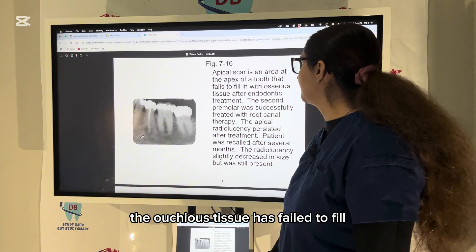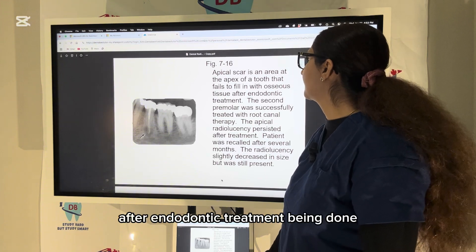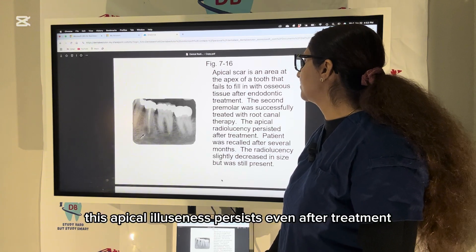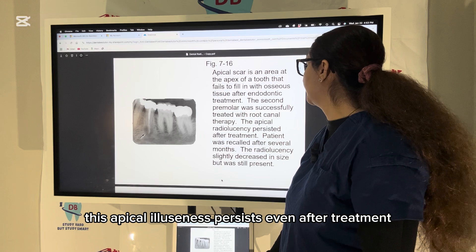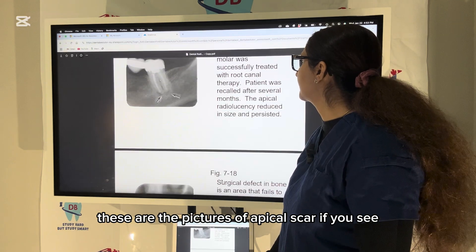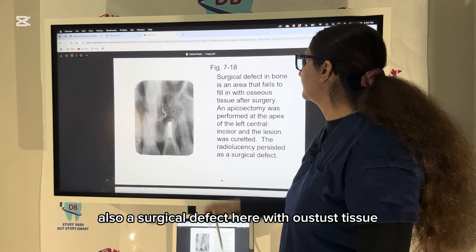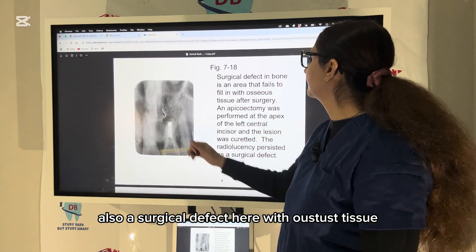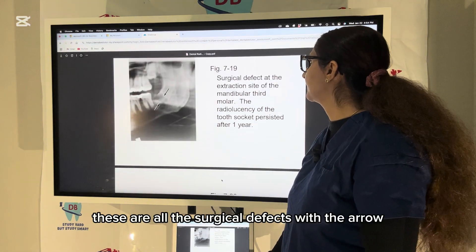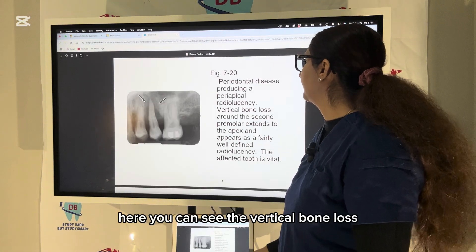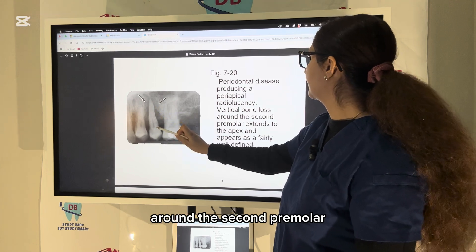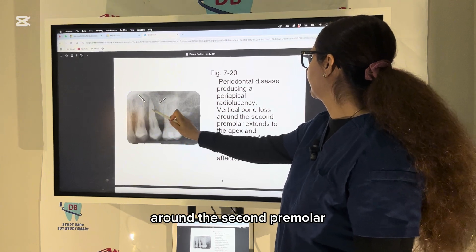Now we can see an apical scar. The scar tissue is where osseous tissue has failed to fill after endodontic treatment — this apical radiolucency persisted even after treatment. These are pictures of apical scar. You can also see a surgical defect here with osseous tissue after surgery. These are all surgical defects indicated with arrows.